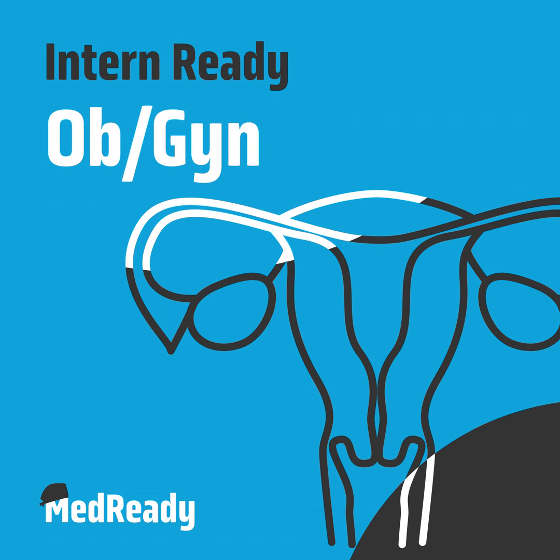The benefits are we can get usually very good diagnostic sampling, as well as if there is a polyp or a submucosal fibroid, being able to do sort of a therapeutic, addressing their symptoms. Yeah. And then in terms of risks, as we would for any surgery, we think about pain, bleeding, infection. All of those are fairly low risk in a hysteroscopy. The other more unique risks that we think about are things like uterine perforation. This can happen often when someone is getting dilated, especially if someone has cervical stenosis. You can think about them being at a higher risk for that.